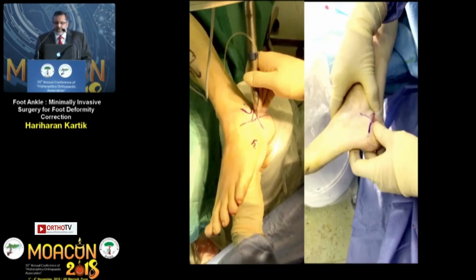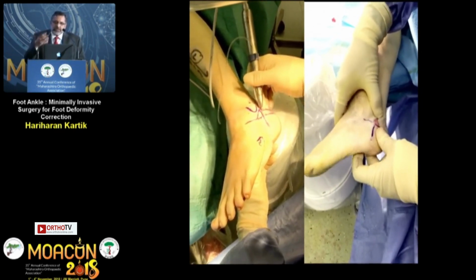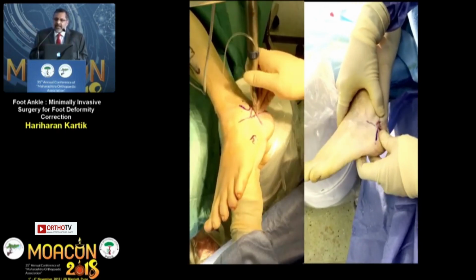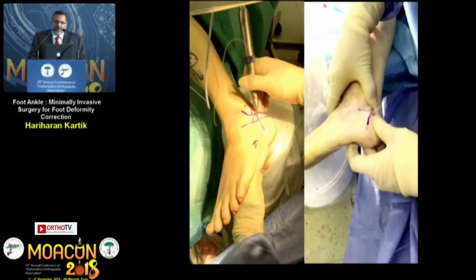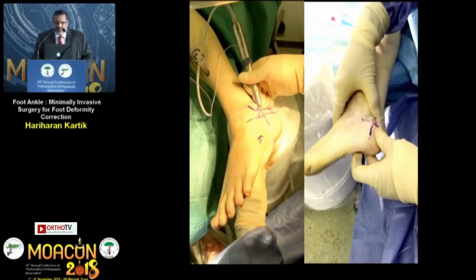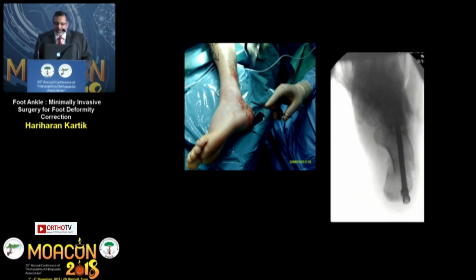The beauty of the osteotomy is that because you lose 3 millimeters of bone, the osteotomy is extremely mobile, so you don't really have to open, you don't have to distract and wait for the soft tissues to relax before you move the osteotomy. So it makes it much easier to shift your osteotomy both medially and laterally. The eventual scar is very tiny, which again extols the virtue of this osteotomy. And you can see we can have huge shifts because of the mobility of the osteotomy.